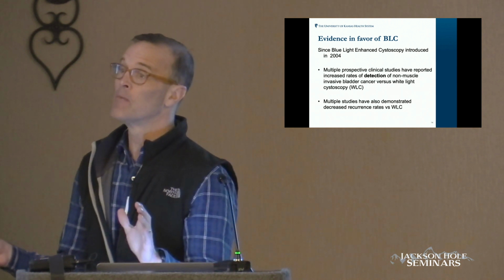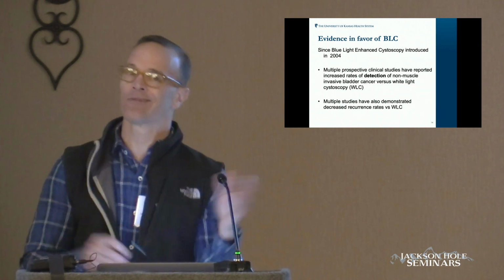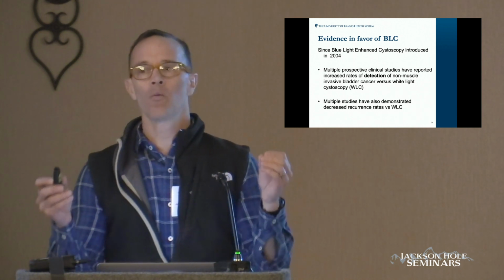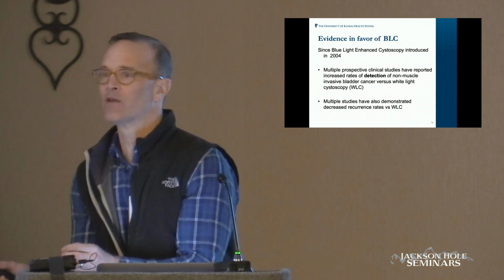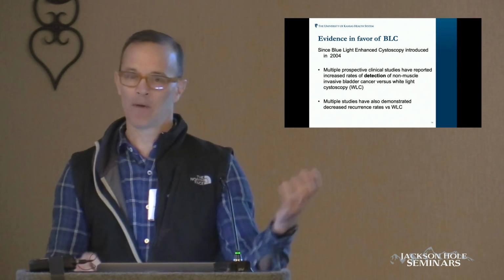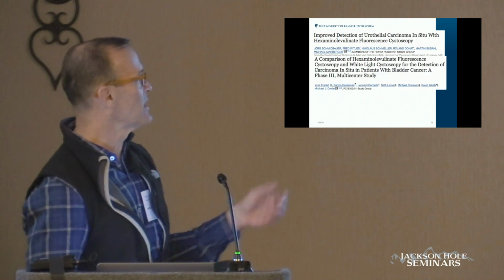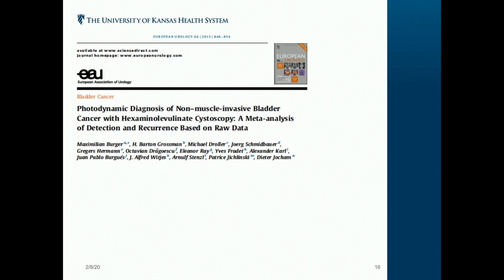And I think that's probably the most important point because really that's what we want to do, right? Particularly with low-grade stuff, if you miss one, you have to come back. It's not the end of the world. But we want to change people who are high risk going on to develop muscle-invasive disease or preventing the need for cystectomy. We're close, but we really haven't demonstrated that. But I'll show you those studies as we go through them. So here again are numerous studies that demonstrate that you can increase detection rates with this.